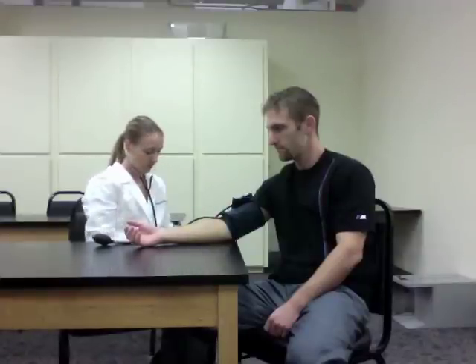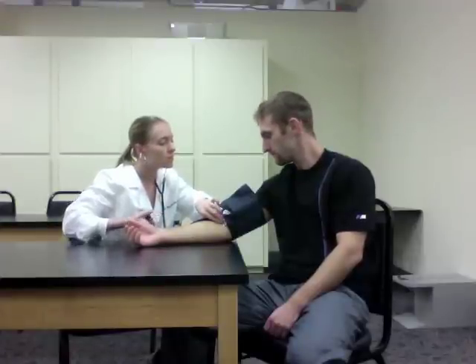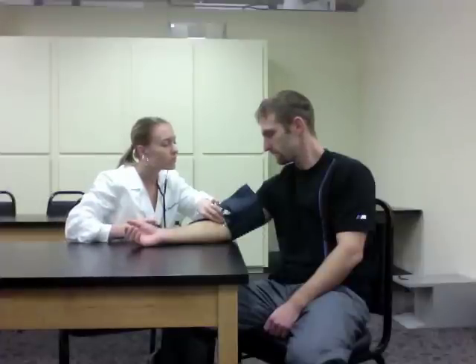After the cuff is wrapped around the subject's arm, the observer should squeeze the bulb to increase pressure in the bladder. A useful method in predicting the systolic pressure is to observe through palpation of the radial artery the approximate pressure where flow is occluded. Once pressure begins to fall again, the return to flow should be around that pressure. The American Heart Association instructs observers to inflate the cuff rapidly to about 70 millimeters of mercury, then increase by 10 millimeters of mercury while performing the above palpatory method until flow has definitely stopped.